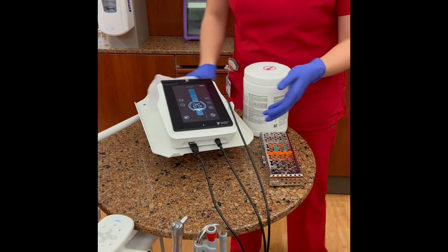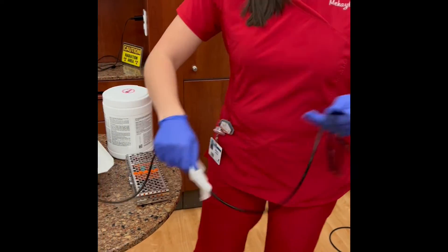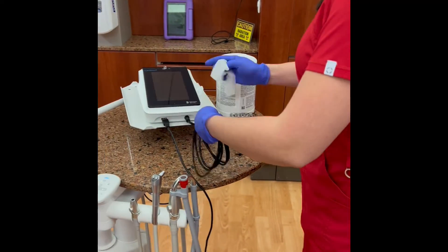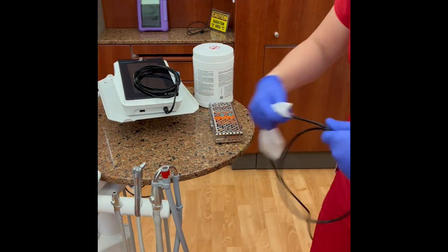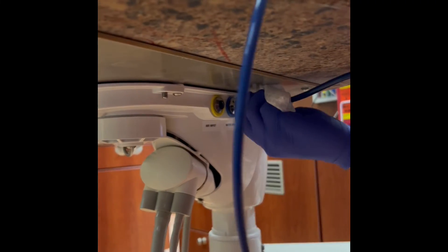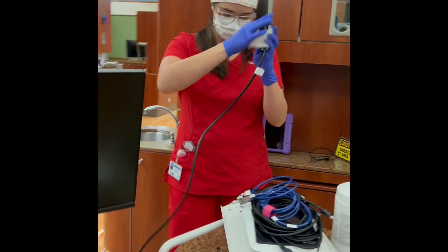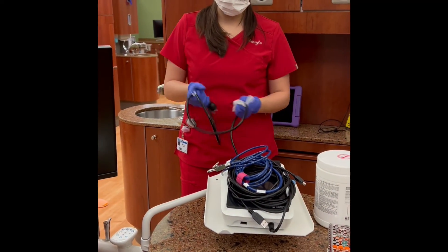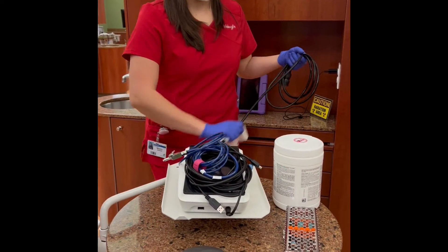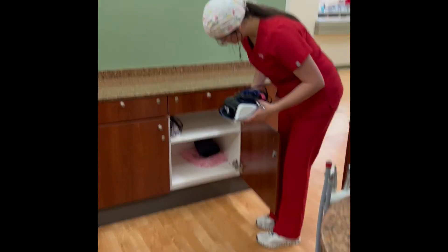Wipe down the Cavitron and cords and the foot pedal with a disinfectant wipe. Wrap up the cords carefully and put away neatly.